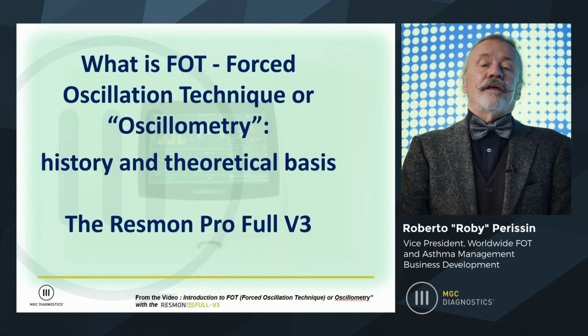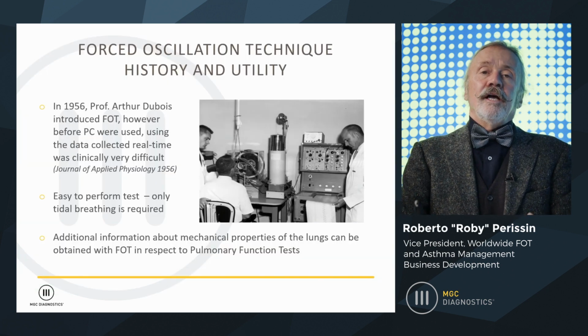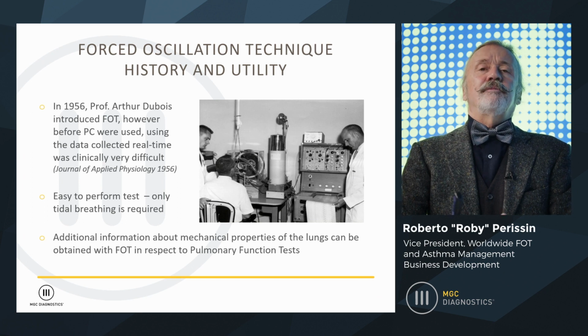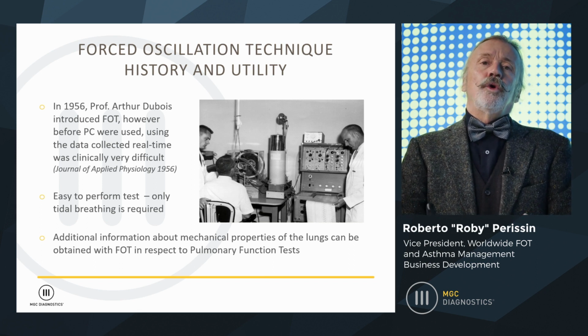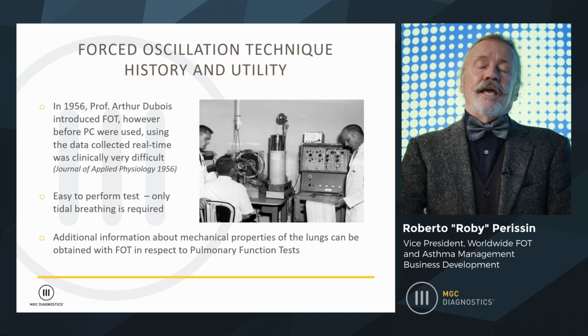Let's now go with the history and theoretical basis of oscillometry with the Resmon Pro V3. Oscillometry is not a new method. Everything has been written, everything has been published, everything has been validated about oscillometry. However, it's been restricted mostly to non-cooperating subjects, which is really what has changed today. The technique dates from the 1950s.